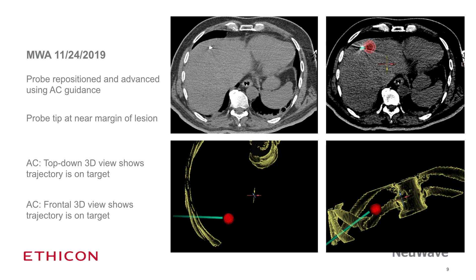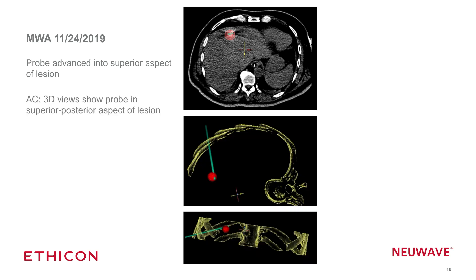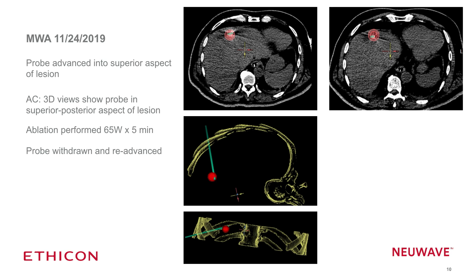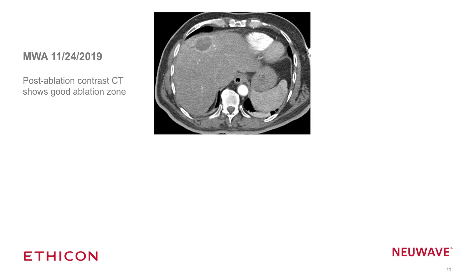We advanced our probe. In this case we decided to do two adjacent ablations to ensure a good ablation zone, given the difficulty in visualization. We advanced first into the superior aspect of the lesion — the 3D views confirmed the probe was well positioned in the superior posterior aspect — and performed a five-minute ablation at 65 watts. We then withdrew and readvanced the probe into the inferior anterior aspect of the lesion, confirmed also with the ACS three-dimensional views, and performed a second 65-watt, five-minute ablation.